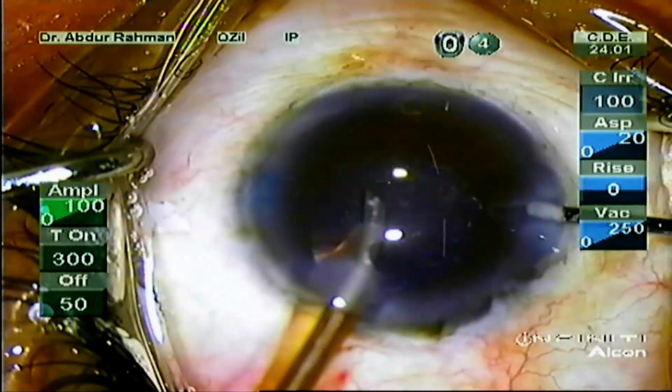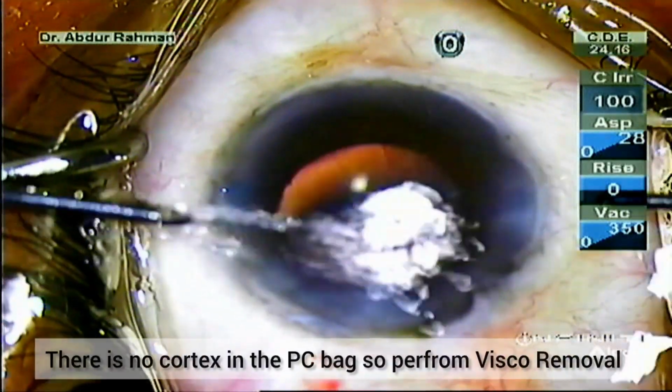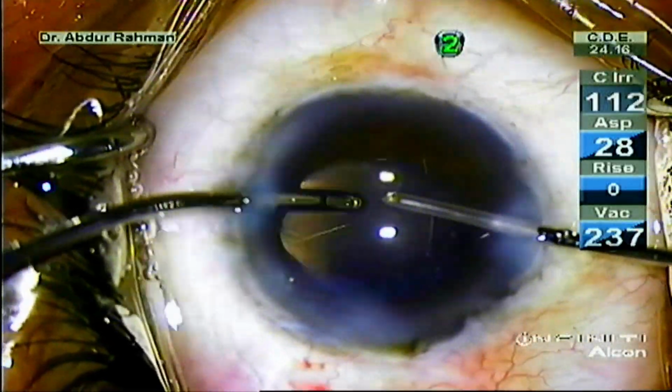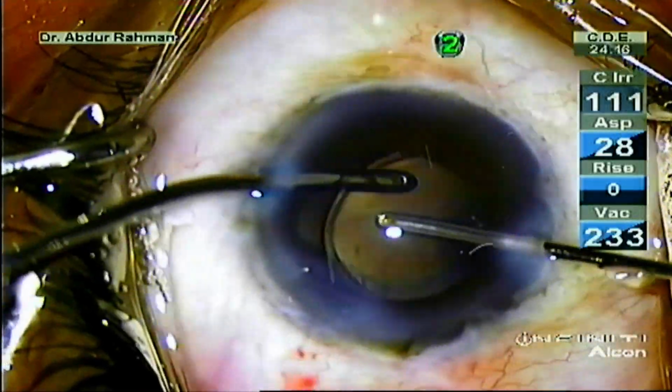Yes, I have emulsified all the small chopped pieces. Now the surgery is almost completed. Only remaining part is removing the OVD. Because there is no cortex, I am not removing cortex. Now I am removing the OVD from behind the IOL.